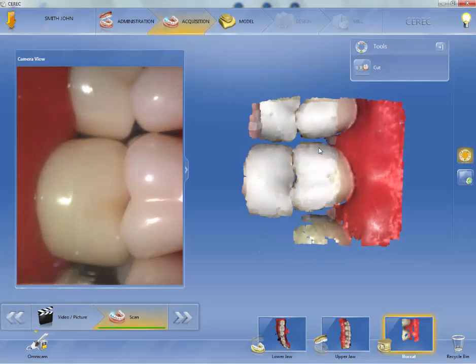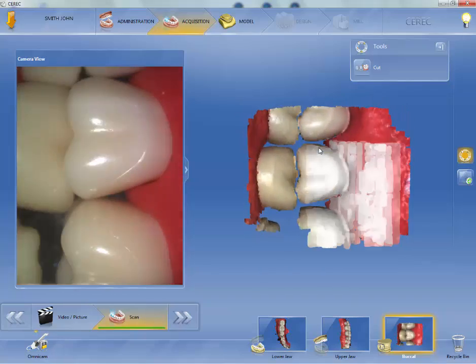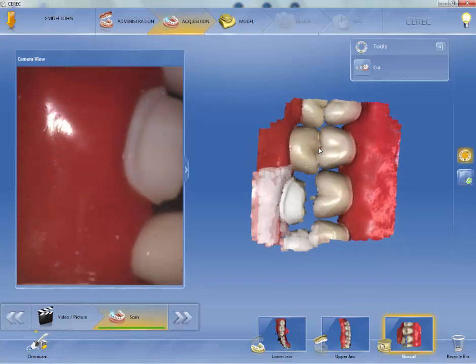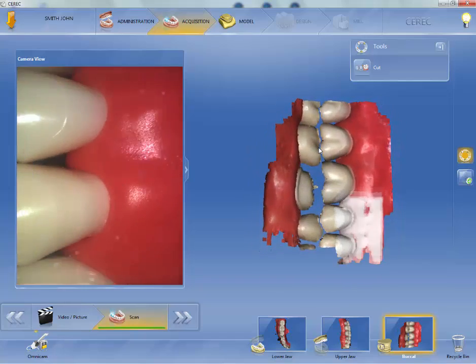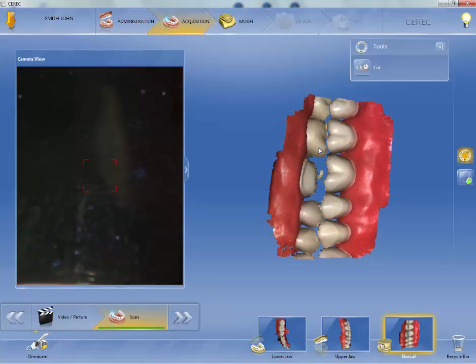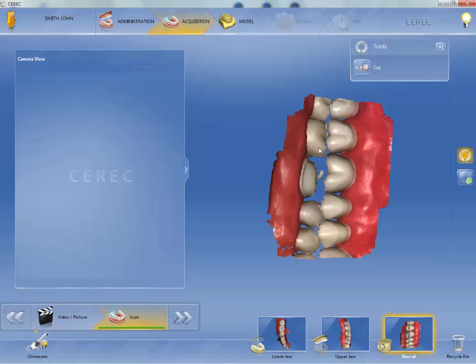place the camera, and now it's very important that you tell your patients to make sure they stay biting. So I always tell my patient, please stay biting, don't open. And then when you take this picture, don't go any farther than what you did on the upper and lower arches, which means I went to the cuspid, and as you can see, I'm slightly short of the cuspid right now. So this is an important part.